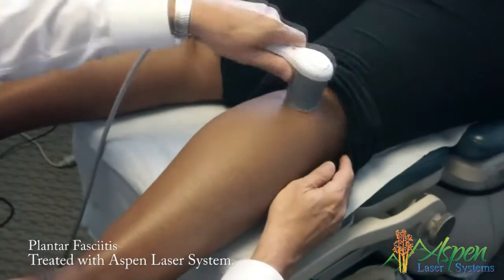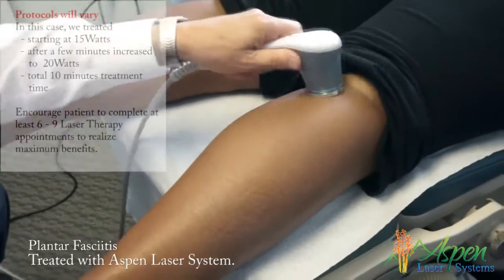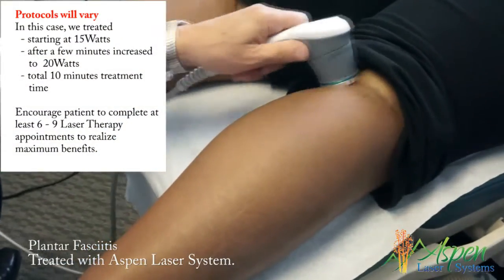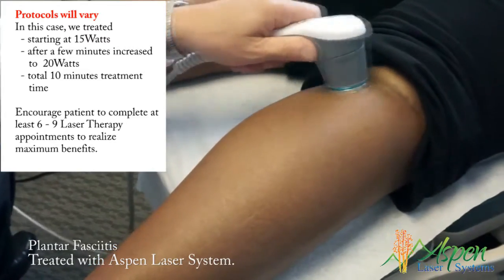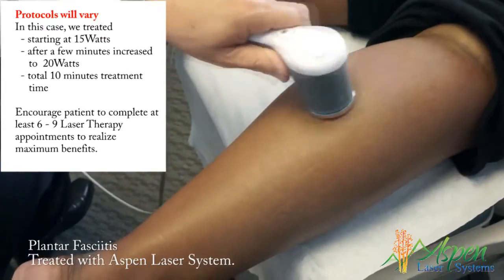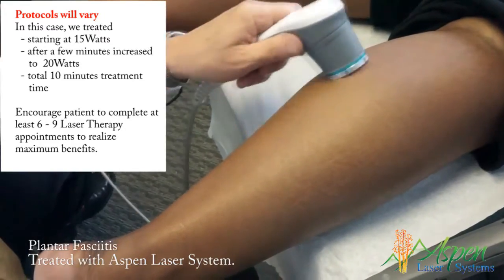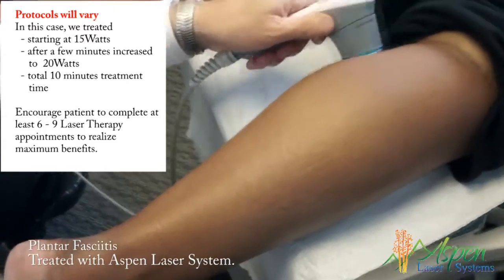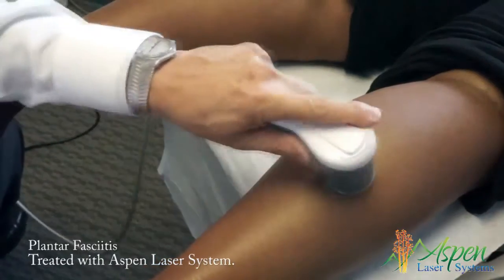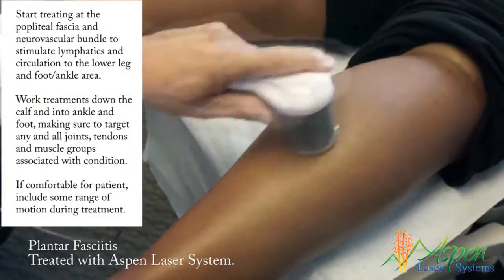As it gets too warm, you let me know — it should feel good. We're stimulating the lymphatics and the neurovascular bundle up in here. We'll do this for almost a minute. You can go the long ways or you can go circular. Halfway through I'm going to have you move your ankle back and forth. This is called bio-stimulation, where we're stimulating ATP production through the mitochondria.